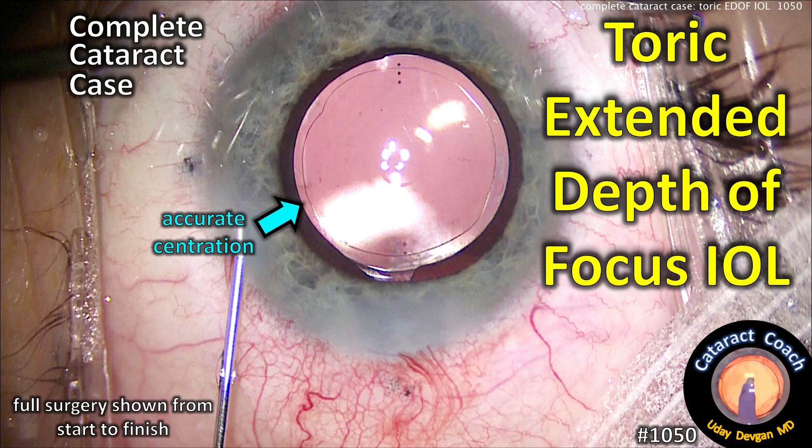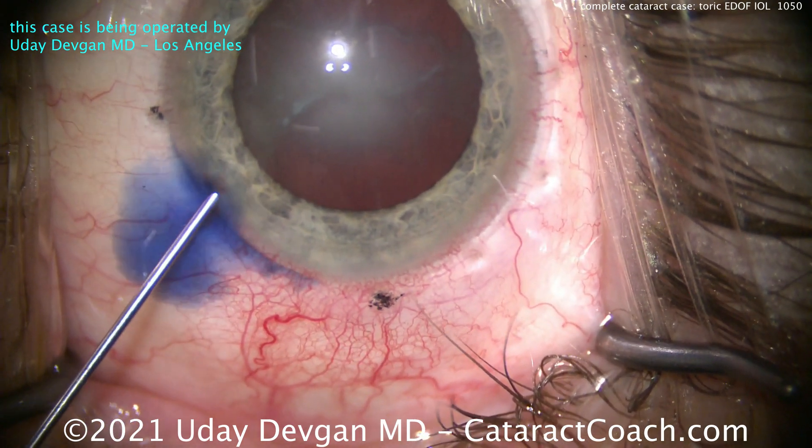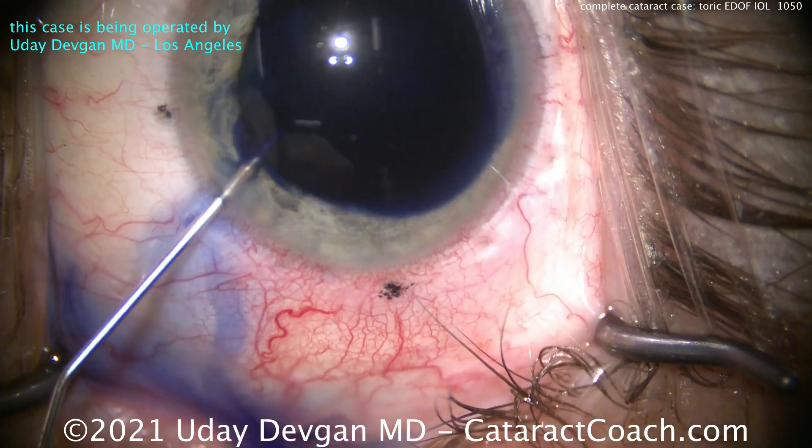Welcome to cataractcoach.com — a complete cataract case featuring a toric extended depth of focus IOL. You can see a beautiful outcome in the picture. Let's show you the whole case start to finish. This is a young patient in his 40s.